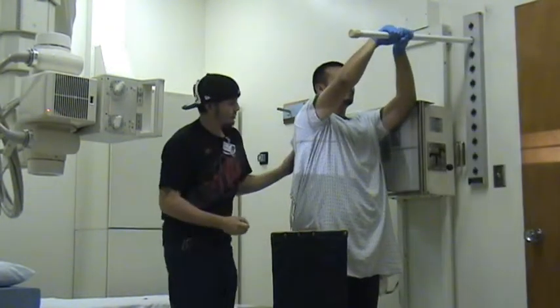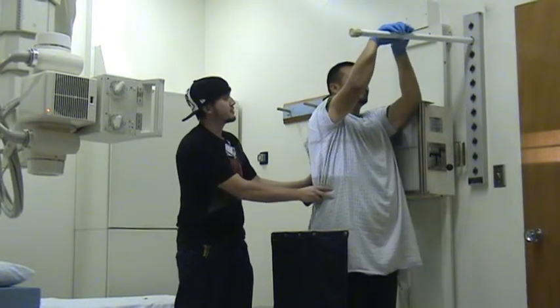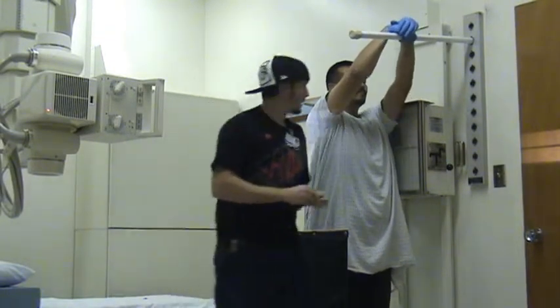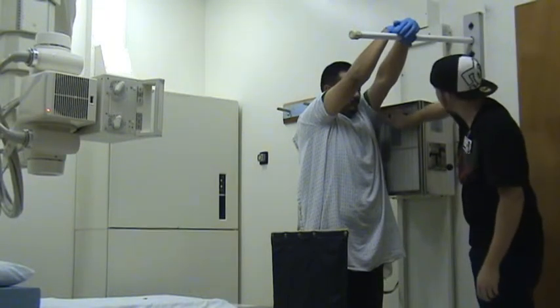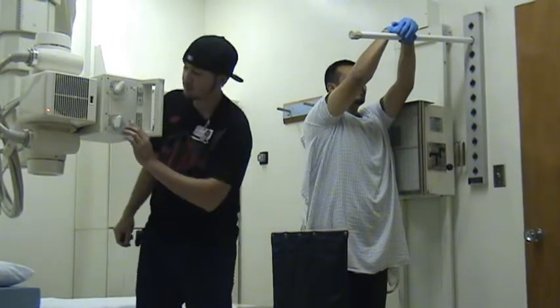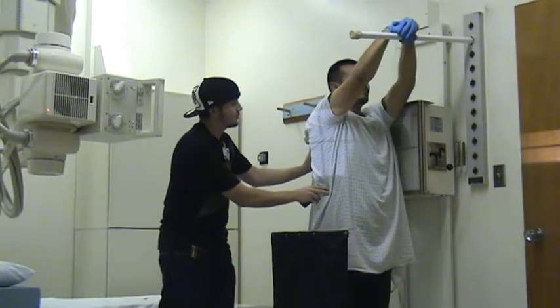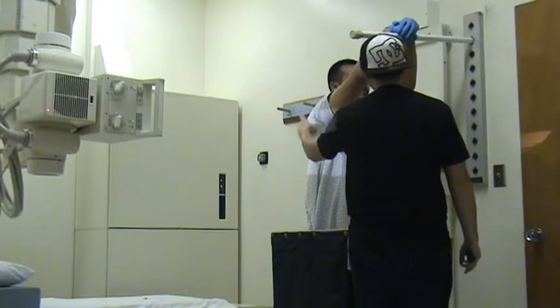And what we're going to do is have the patient scoot on over to his or her left. Make sure that the marker, I like to put the marker behind the arm here so it doesn't get burned out. And still on the left side. And we are going to adjust the patient so that the crosshair is right in the middle, vertically.